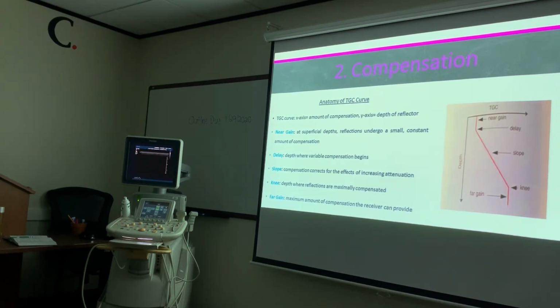It's gonna take the anatomy and it's gonna kind of even it out as much as it can according to what's being shown. That's why when you move it around, it'll change. Every time you move, it'll change because it's trying to optimize the information that's on the screen. And that's also just perception. Yes. It's kind of like a combination of amplification and compensation.